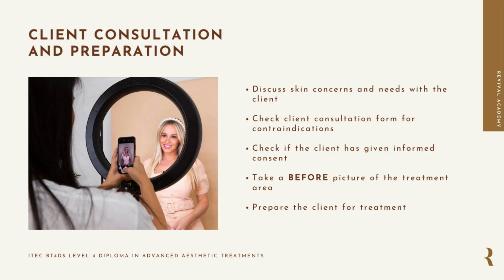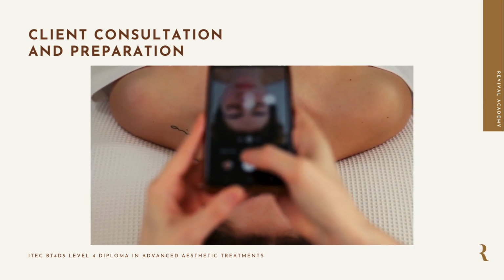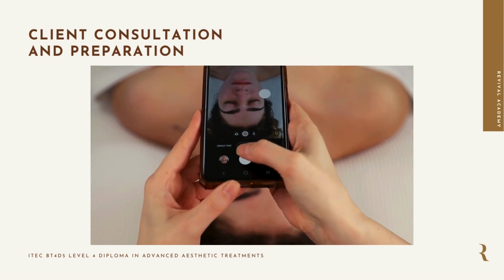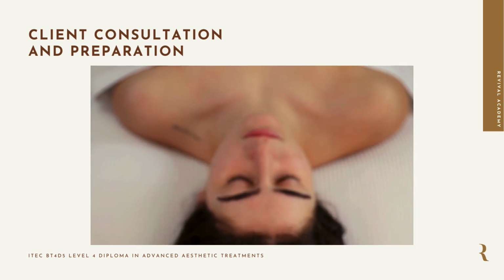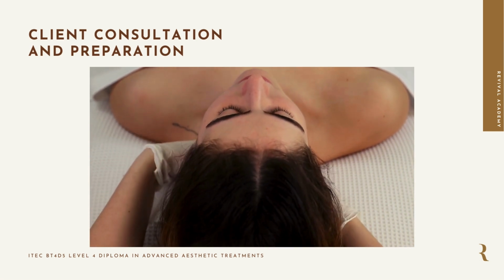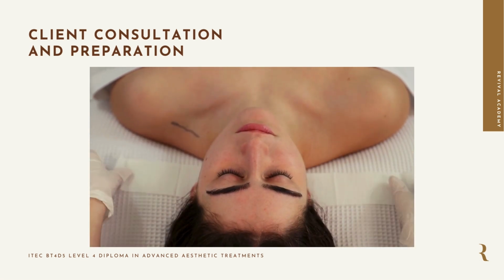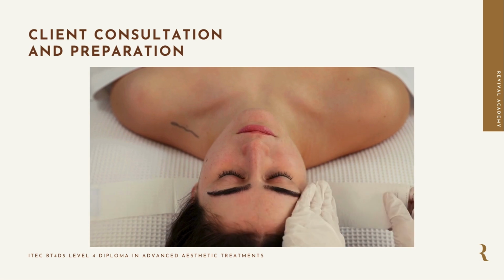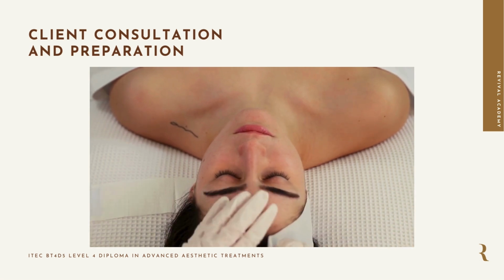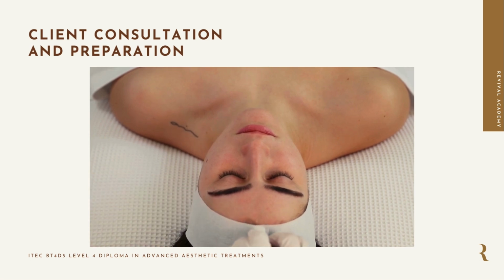Next, you will need to check the client's consultation form for any medical history or any contraindications, as well as whether they have signed and given you informed consent. If the client has no contraindications and they're suitable for the treatment, then you can take a before photo of the treatment area, put your gloves on and place a headband on the client. Now that's done, you're ready to begin the treatment. Let's look at the first step.